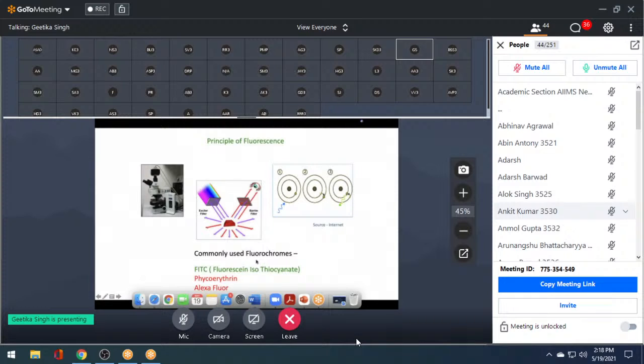So these are very special compounds called fluorochromes. And this is the property that they possess, which we are using in this investigation. And there are a lot of other fluorochromes as well. I'm just highlighting one or two here, like phycoerythrin or Alexa Fluor. So in phycoerythrin, green light is the exciting light and it gives a red color. Similarly with Alexa Fluor. Okay. So it's such an important compound, and this property we're using so extensively in coming to kidney diagnosis.